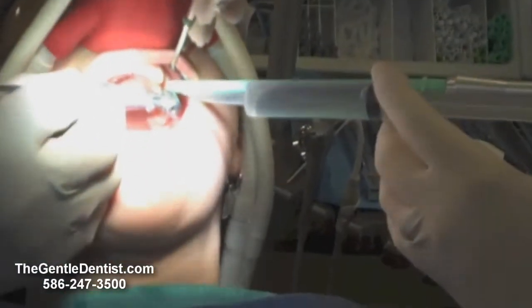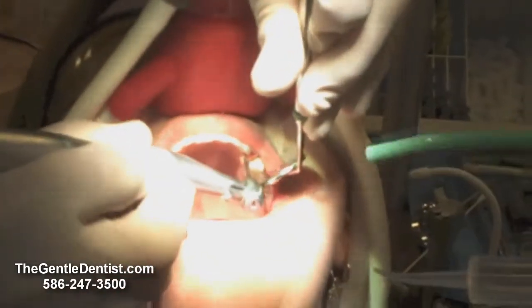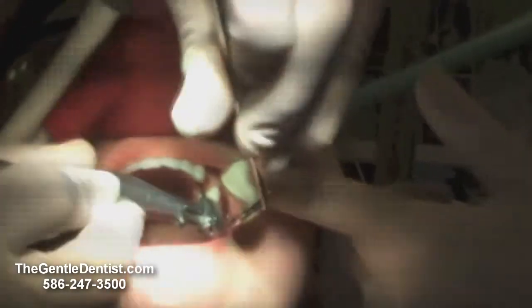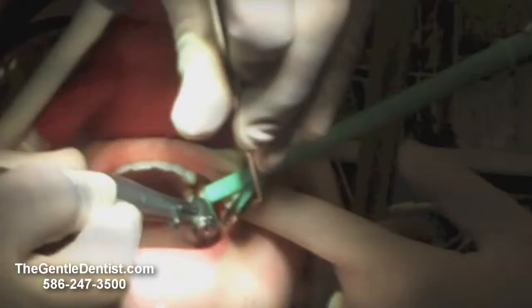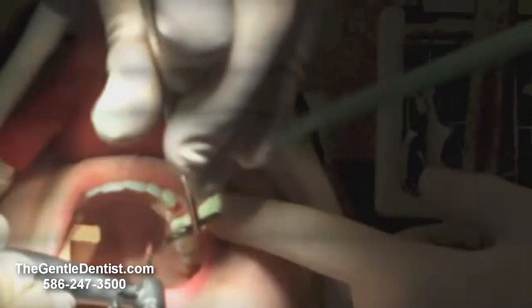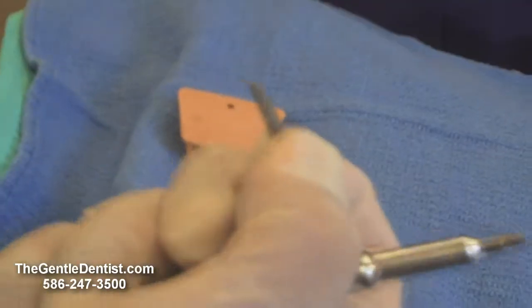We went ahead and provided adequate anesthesia for Kristen. Now we're going to create what's called the osteotomy, which is basically the hole that is going to be used for placing the implant. We do this in sequential sizes, getting larger and larger. It's almost like a wood screw that goes into the bone. This is done so that when we tighten it up, it has enough torque and ability to hold in. This is also the implant that we placed in her mouth.